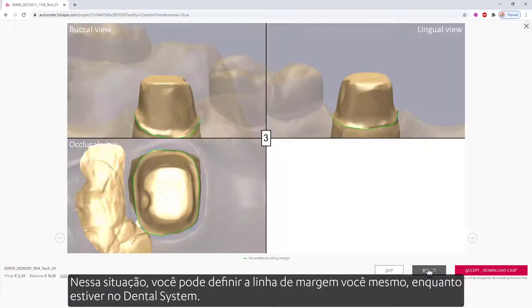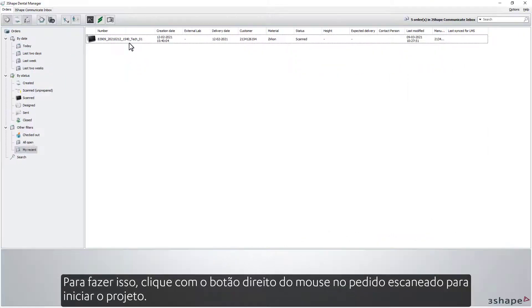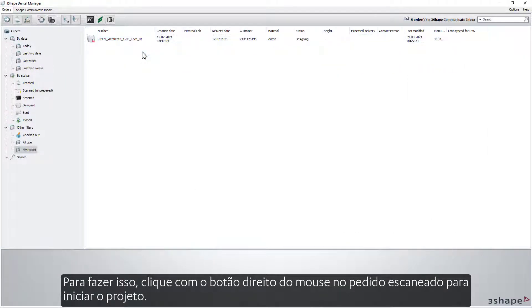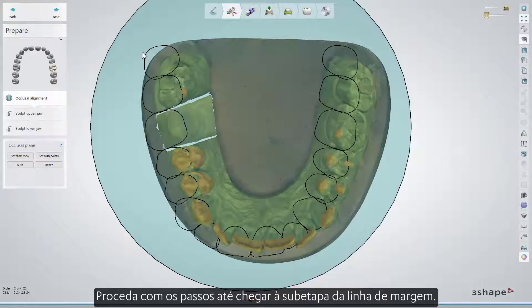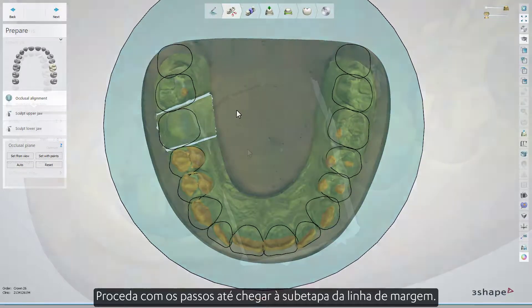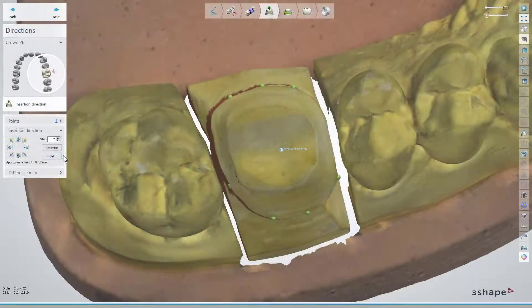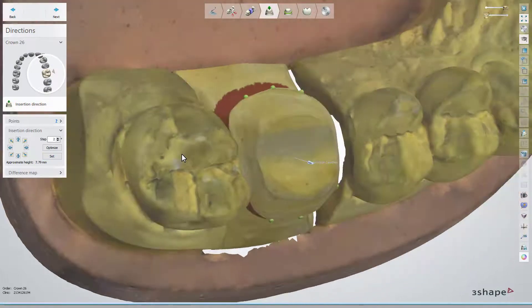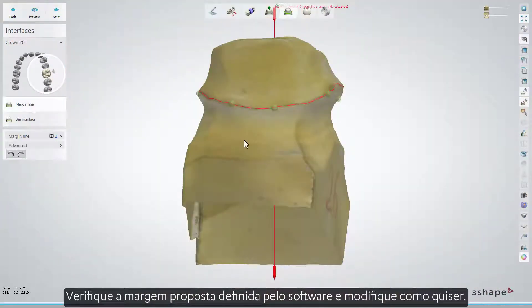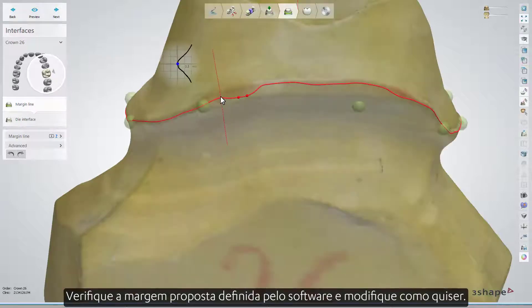In that situation, you can set the margin line yourself while in Dental System. To do so, right-click the scanned order to start the design. Proceed with the steps until you get to the margin line sub-step. Check the proposed margin set by the software and edit it as you want.